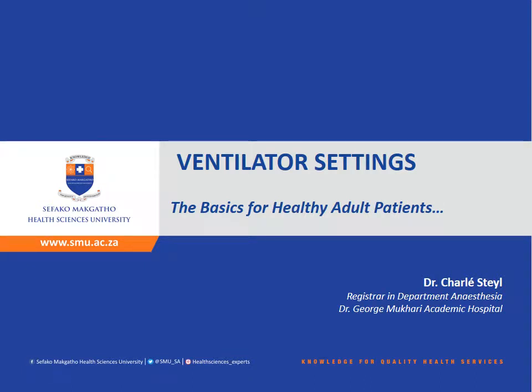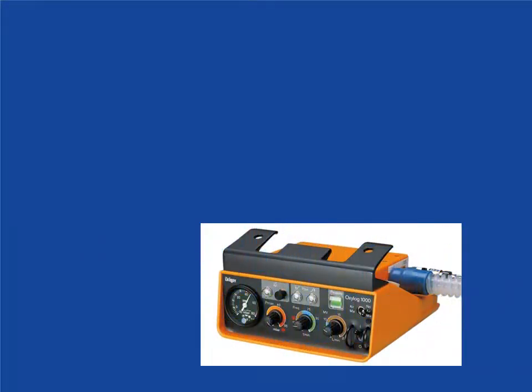Hello! In this talk we are going to look at some very basic settings for the ventilator. This talk is aimed at anyone who feels a bit intimidated when they look at a ventilator. There are lots of different types of ventilators depending where you work.